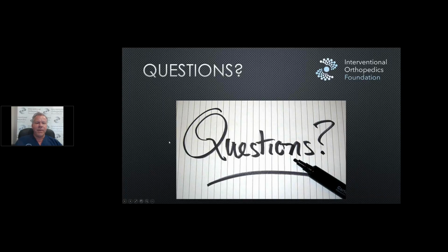John, below the end plate and into the vertebral body? Yes, John. So again, it could very well be that that is absolutely necessary to treat some patients and to get them better. I don't think anyone knows at this point, and it's a reasonable thought for sure.